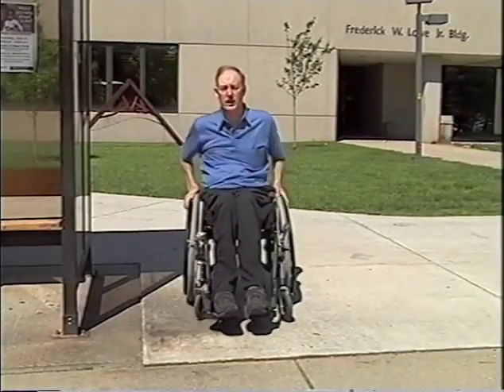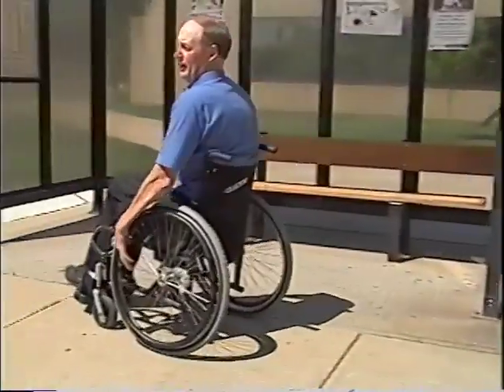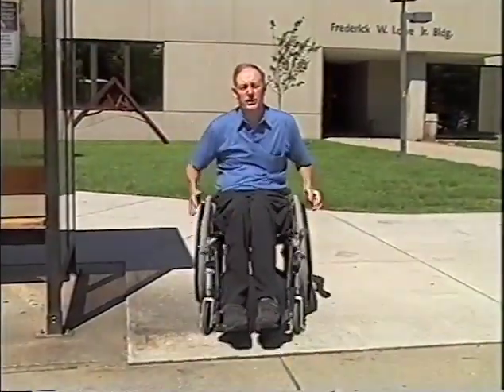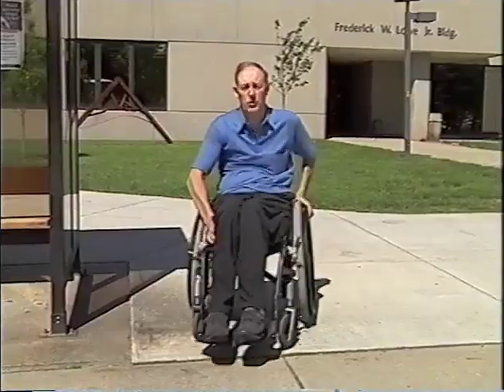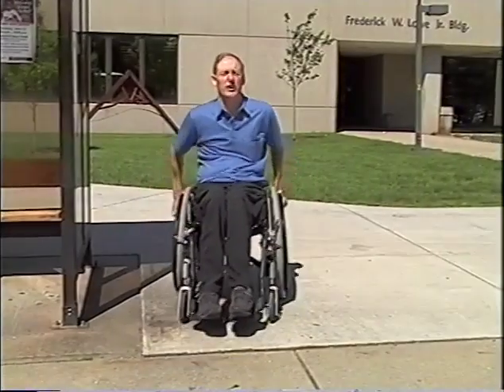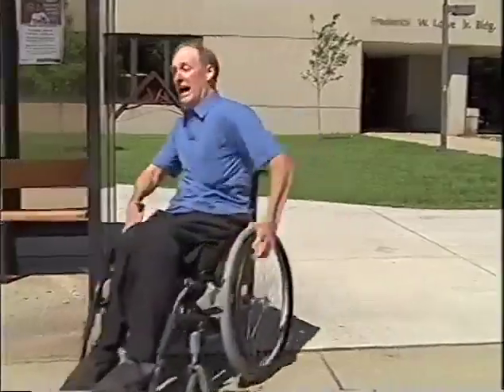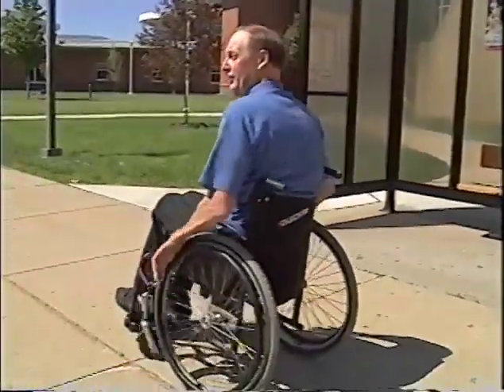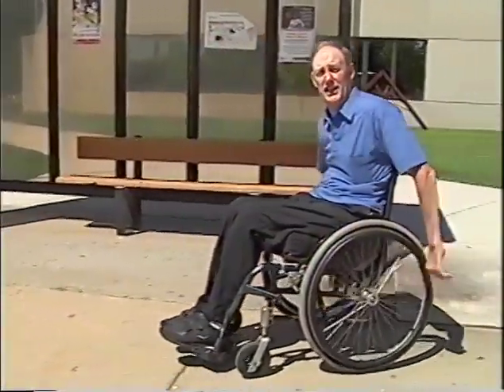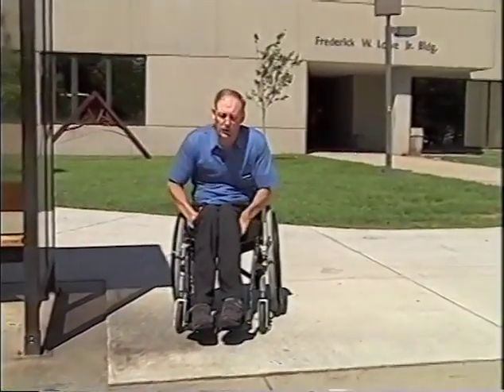The second way to corner is to push on the outside wheel and make the same corner. When you're cornering this way, at least you're keeping the energy you're putting into the wheelchair, and it's more efficient. The problem with this method of turning is if you're going at a fairly good clip to come around the corner, now you have to really push like crazy to make it around the corner. And if you're inside a building, people frown on getting run over. So you have to use that where it's appropriate.